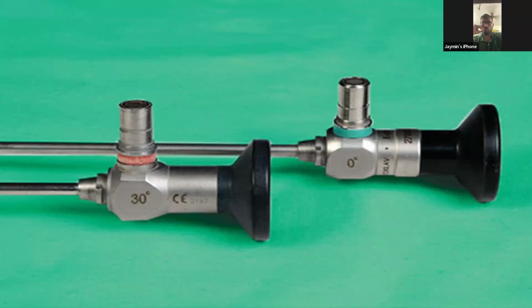So yes, sir. With regards to degree, that was 70 degree for the dome and 120 degree for the bladder neck. Now the basic dimensions of the telescope. It is a 4 mm telescope and a standard length of 30 centimeters.